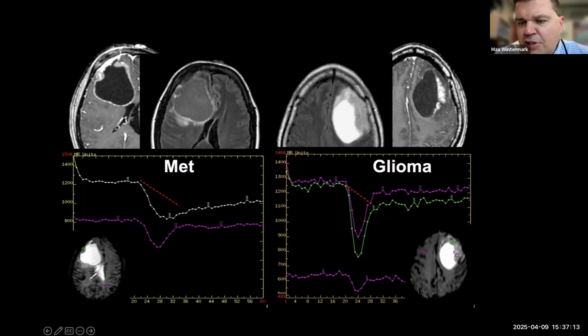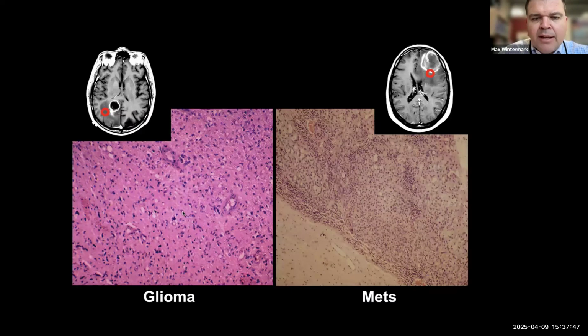Glial brain tumor. Whereas if you deal with a metastasis, typically metastases don't induce the angiogenesis of vessels with blood-brain barrier. So typically when you interrogate the enhancing area in metastasis, there is going to be very poor return to baseline or no return. This helps when presented with a solitary enhancing lesion, to try to differentiate a primary glial brain tumor from metastasis.